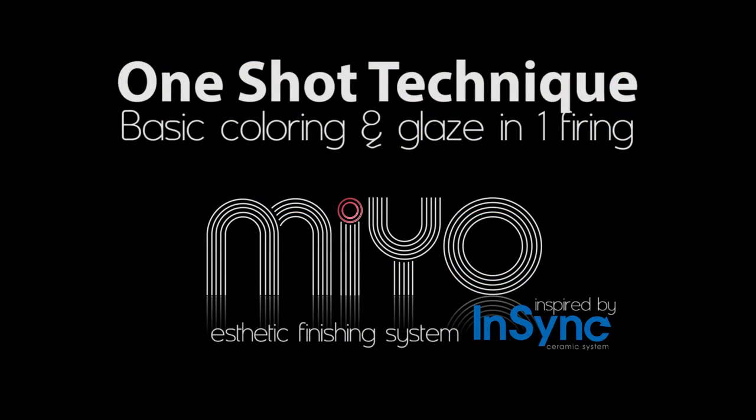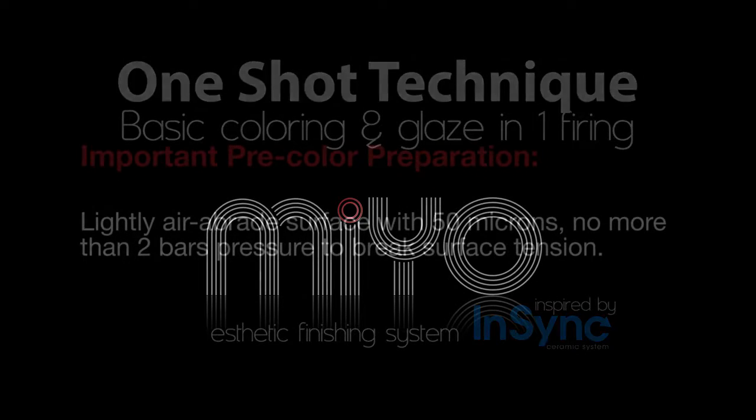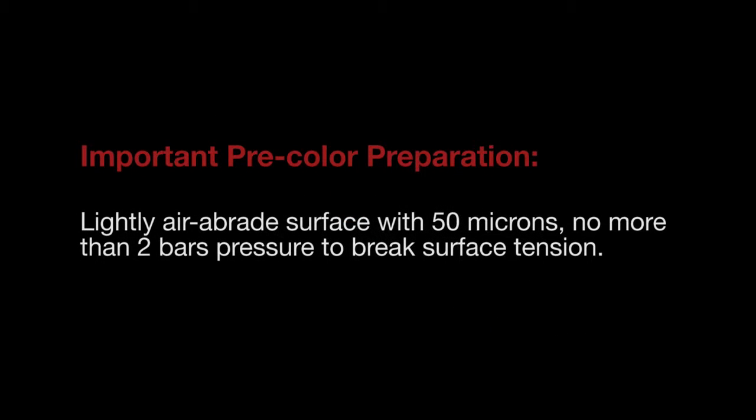This is a short video to introduce the one-shot technique using the MiYO system. There is a very important protocol to eliminate surface tension on your monolithic restoration. Lightly air abrade the surface with 50 microns, no more than 2 bars of pressure, to break that surface tension. Or if you're against any kind of air abrasion, you can rub ceramic powder with glaze liquid to break that surface tension on your monolithic restoration.